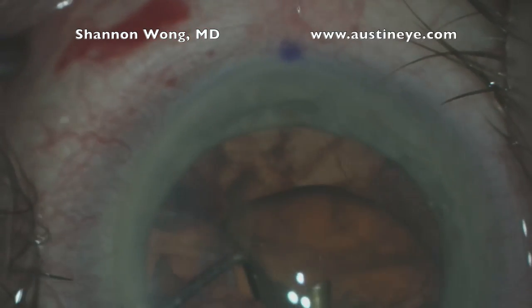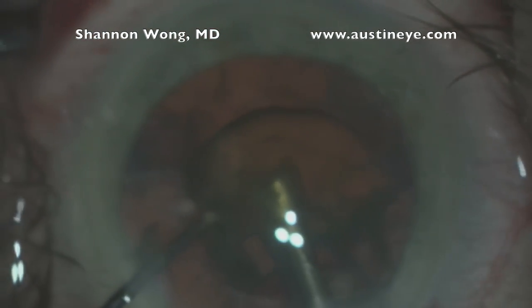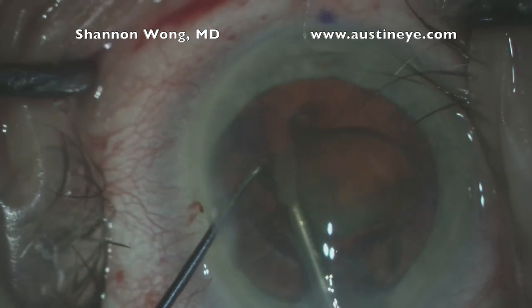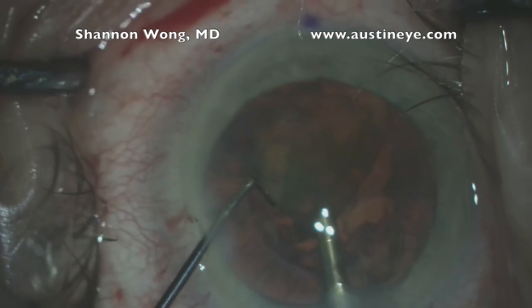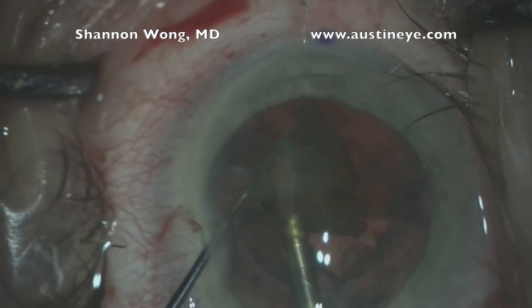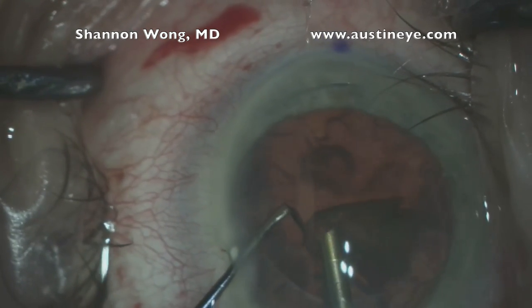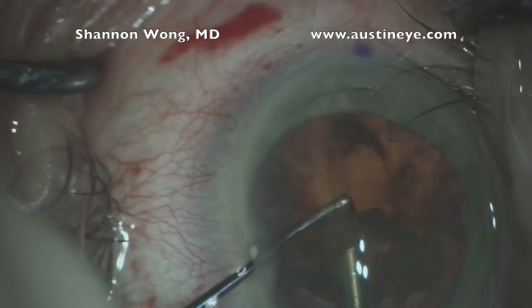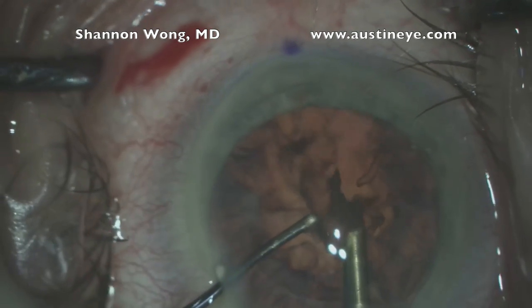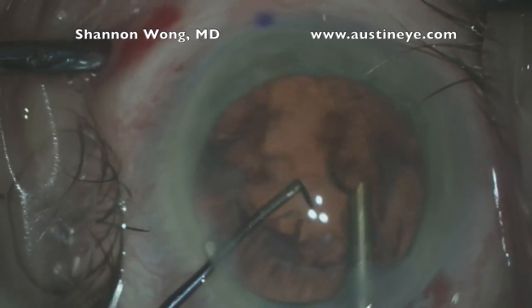In this case it happened at 12 o'clock on the monitor here. We've identified it at the moment that it happened, which is key — therefore we can be proactive to prevent making this situation more involved than it needs to be. This anterior capsule extension appears to go underneath the iris and at this stage we don't know exactly how far it's gone.